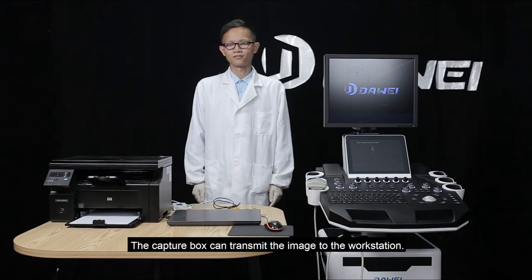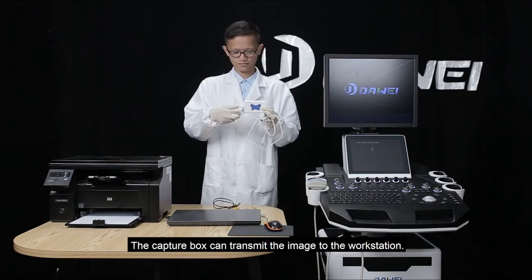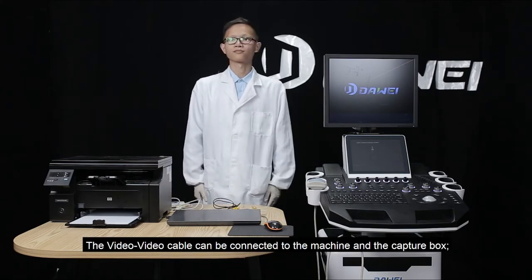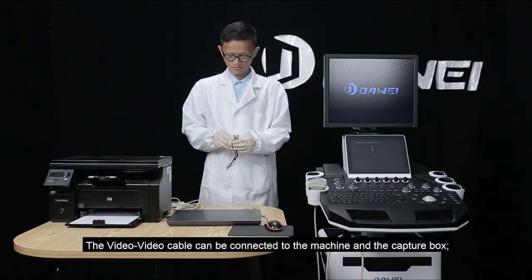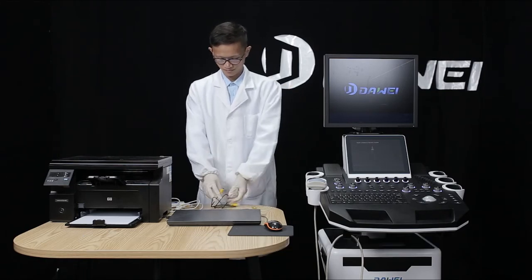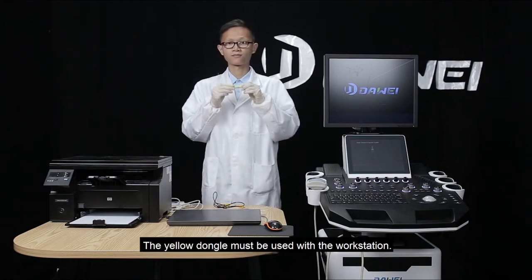The capture box can transmit the image to the workstation. The video-to-video cable can be connected to the machine and the capture box. The yellow dongle must be used with the workstation.